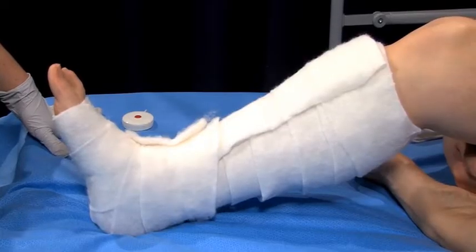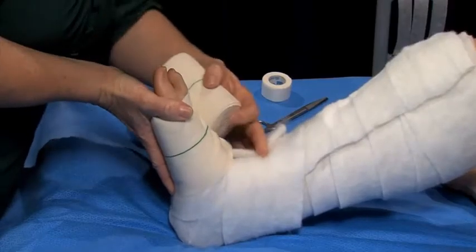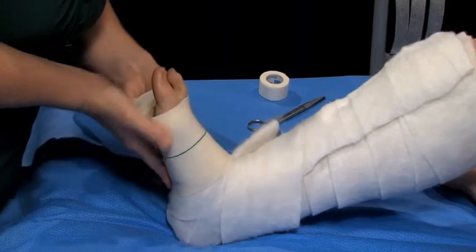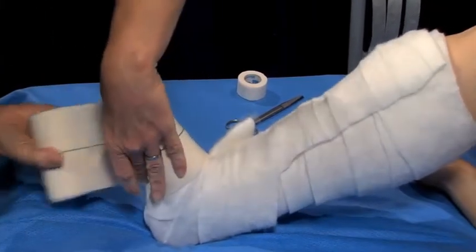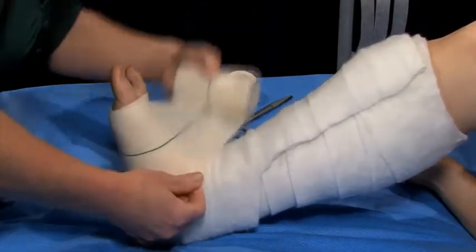Ensure the foot is kept at a 90 degree angle, or in dorsiflexion, throughout the procedure. Hold the bandage close to the limb with the barrel upright while bandaging. This will assist with ease of application and keeping the bandage tension consistent along the length of the limb.